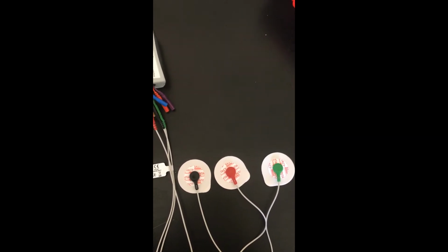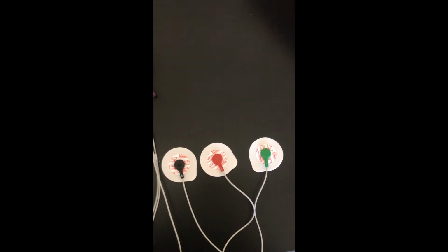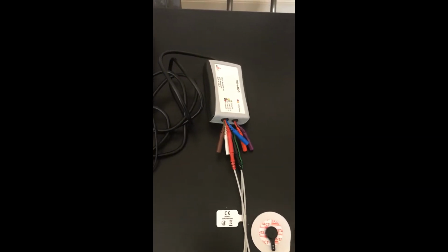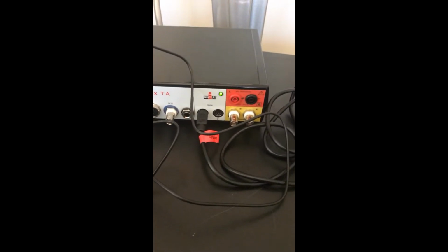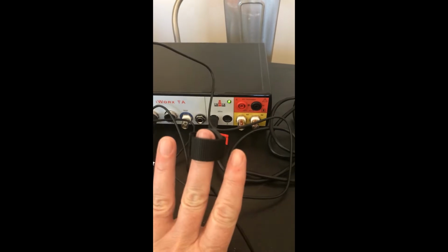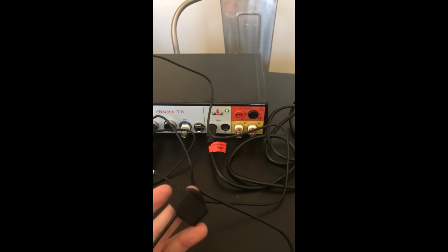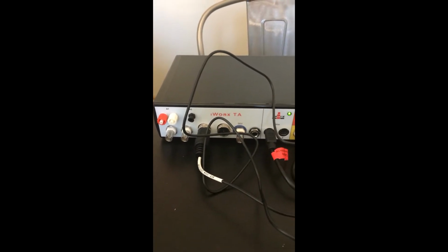Your black electrode is going to go just inferior to the right clavicle, and your red electrode just inferior to the left clavicle. Make sure you have your electrodes plugged in and plugged into the data acquisition box. The final step is to put on your pulse plethysmograph, this little guy, snugly on your finger, and plug it in to the data acquisition box as well.